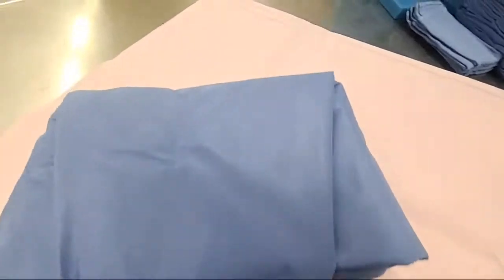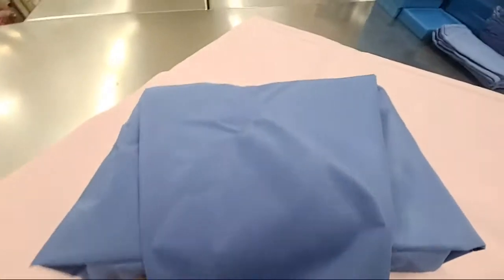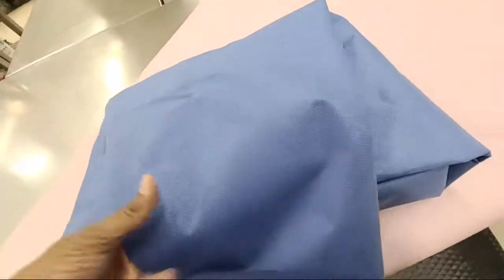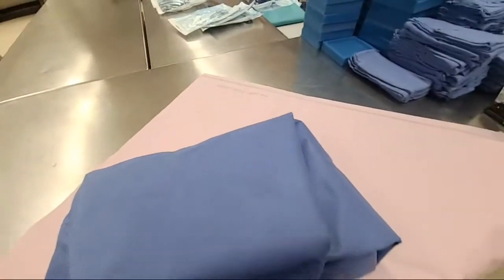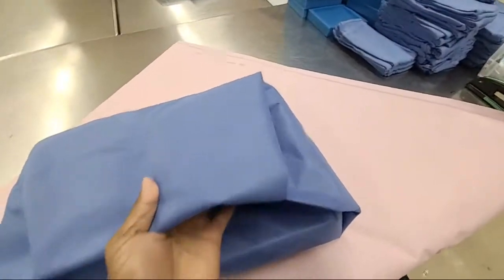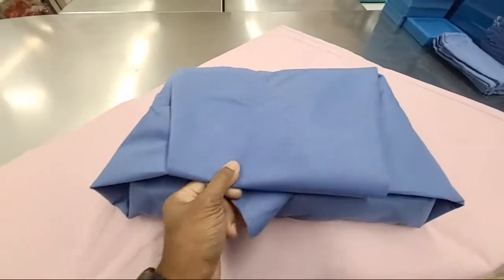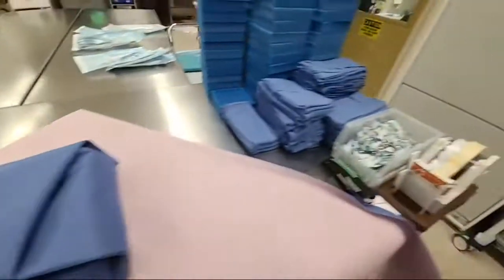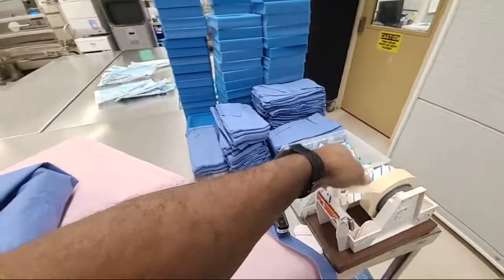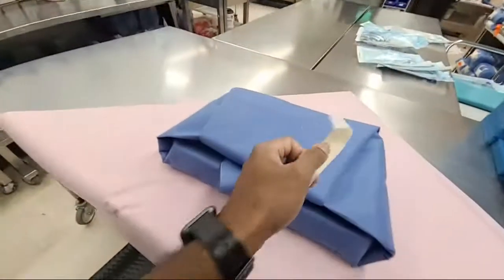And so basically, at every fold, we should be hiding the fold underneath. The whole point is to reduce exposure to the items that are sterile. So each wrap is hiding the previous level. This is very loose. If you're deciding to do this, then maybe I shouldn't have, but you get the gist of it.